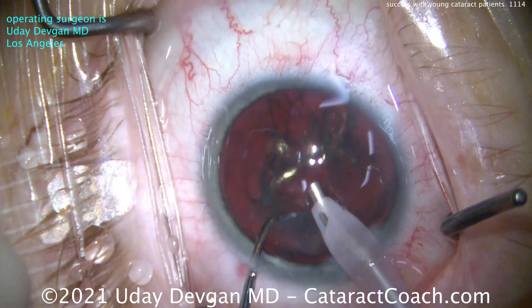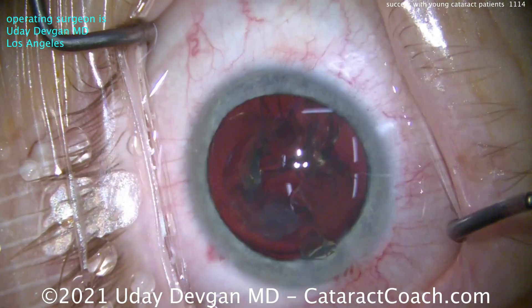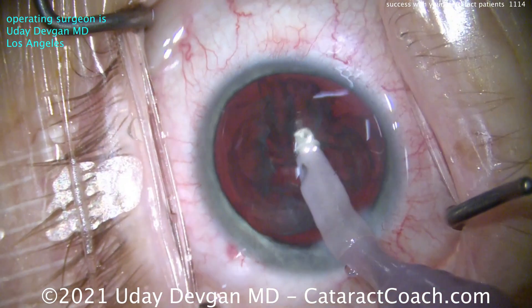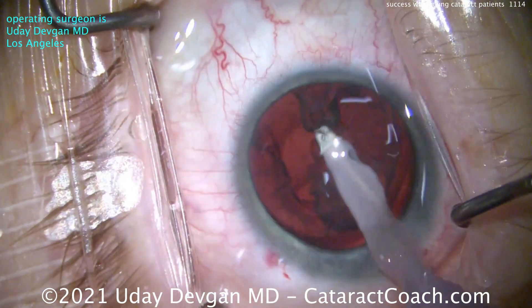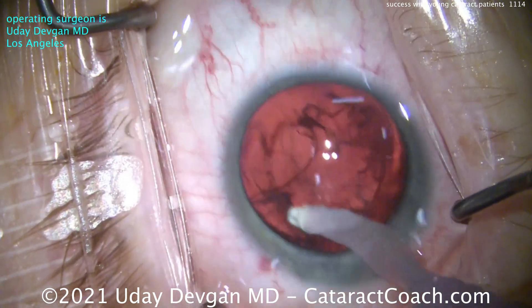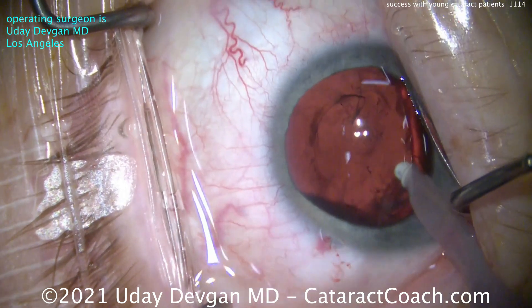The endonucleus is already gone — what's left is just the epinuclear shell. Could you get it with the phaco probe? You can try a little bit, but the answer is no. Why? You can't take any risk, even a 1% or 1-in-1,000 risk — you can't take that risk in this eye. So going with this IA tip — look at the polymer tip, it's soft, it's much gentler. It'll take a little longer to remove the lens material, but I'm in no rush. I want to do this case as meticulous as I can. We're taking all the lens cortex nice and easy, moving it all around, and we'll clean this capsular bag up beautifully.